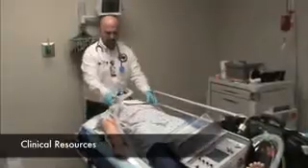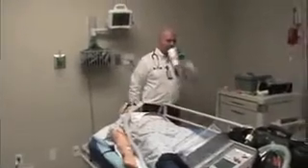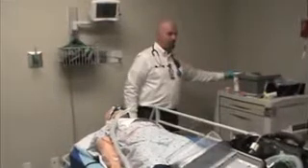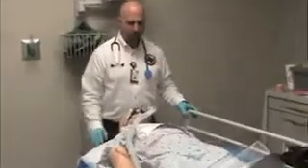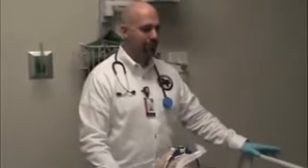Some people aren't very comfortable using a mechanical ventilator, and when they're new at it, they want to know who they can call. If you're having a problem with a ventilator and you're in the sending hospital, the respiratory therapist is always a great person to talk to. They're usually really easy to communicate with, and they'll help make sure that the settings you have on the ventilator are adequate. Before you move the patient out of a safe environment, make sure that everything is working correctly. So an RT is a good resource to use.